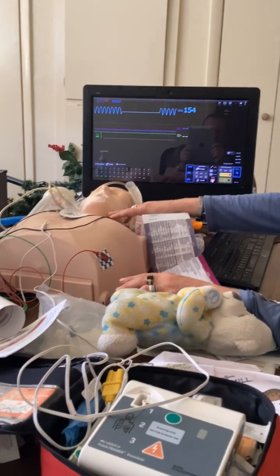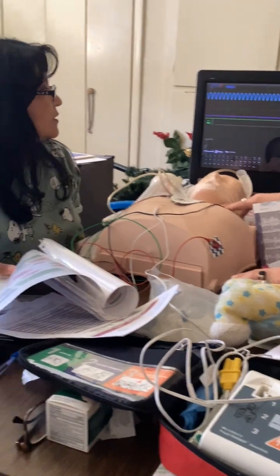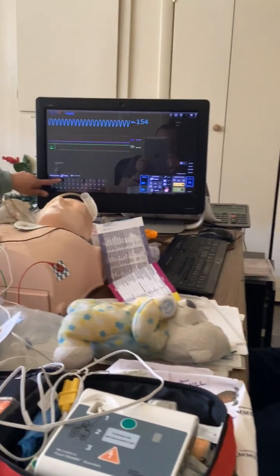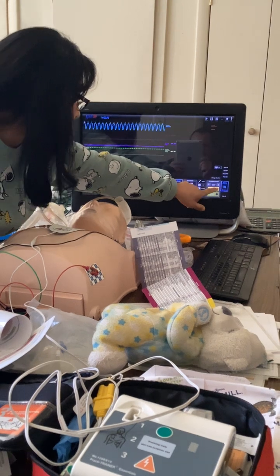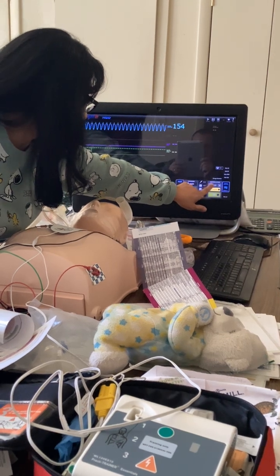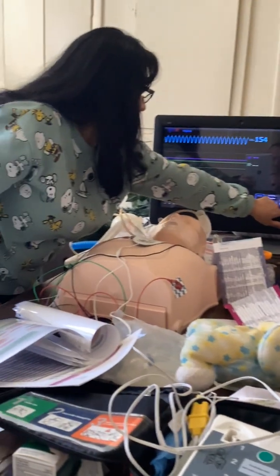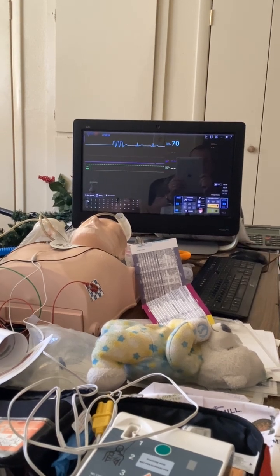I'm checking the central pulses. They're still in VTAC with the pulse. So did a half a joule convert them? Did it convert them back to sinus rhythm? No, it didn't. So you're going to have to hit sync again, and then go up to 1 joule per kilogram. Okay. Charge it. We're clear. Everybody clear? Clear. And they're back in a regular rhythm.